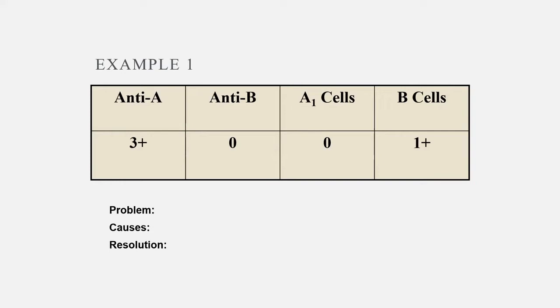So it's perfectly normal if you have a 96-year-old to have weak reverse. It's still called an ABO discrepancy, but we can be pretty sure it's due to the age. So that's why looking at the patient demographics is very helpful: looking at the diagnosis, the age, and pregnancy status.